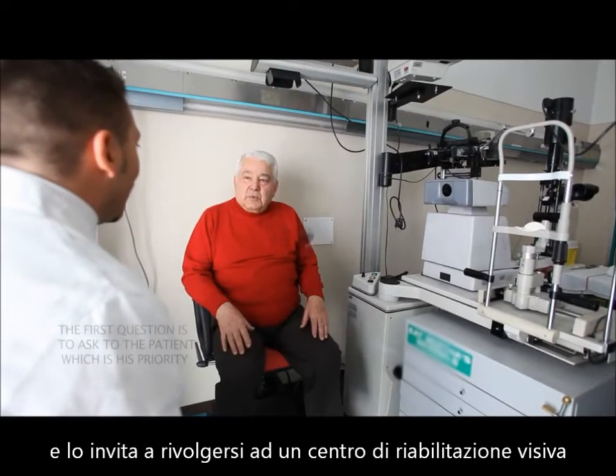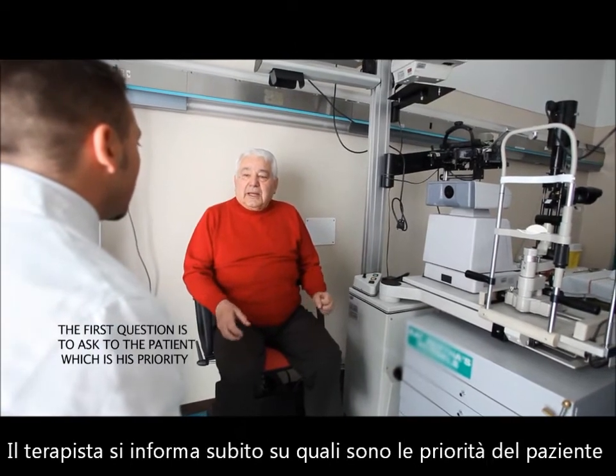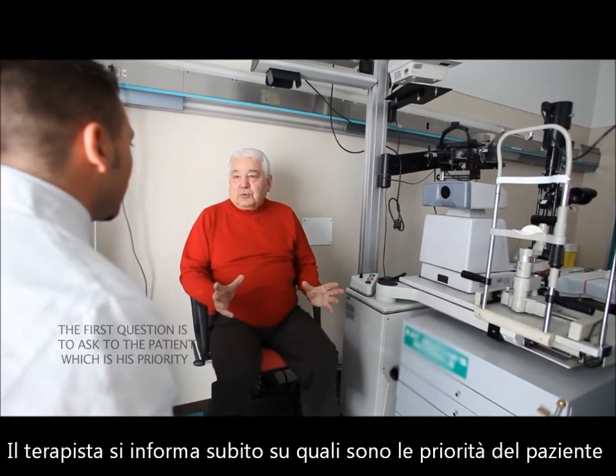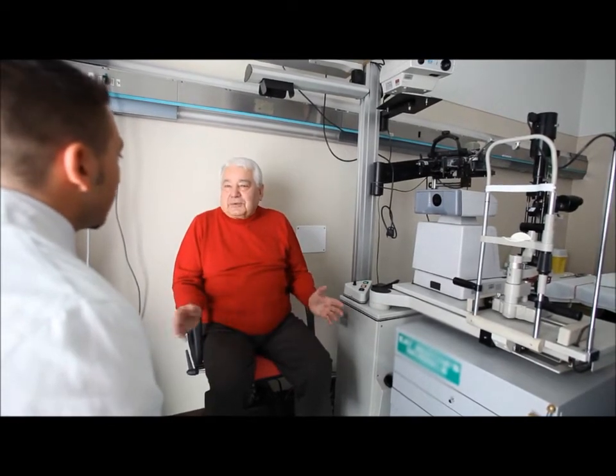Potential can be quantified relatively quickly and simply by means of a factor obtained by dividing the value of visual acuity that is required to read the characters of the newspaper, 20/60, by the patient's residual visual acuity.